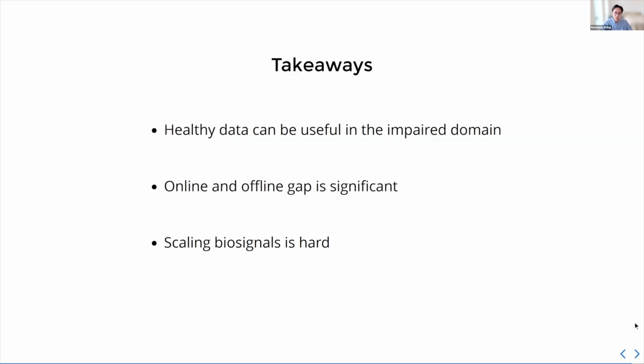And similarly, some of you might know that Meta, the company, recently released a wristband for EMG. And they have over 1,000 participants with over 1,000 hours of data. And the results are pretty good. It works quite robustly on healthy. So I do believe that scaling biosignals is very important. We should definitely do that. But without a standardized sensing interface, I think reusing data sets will be very difficult.